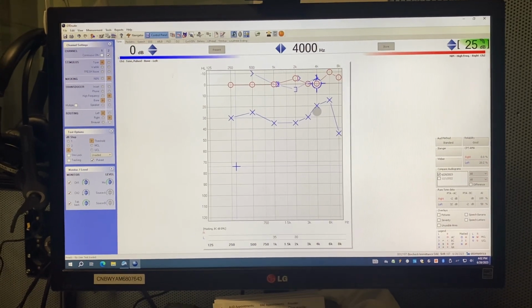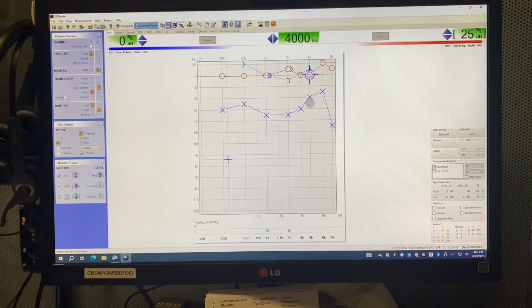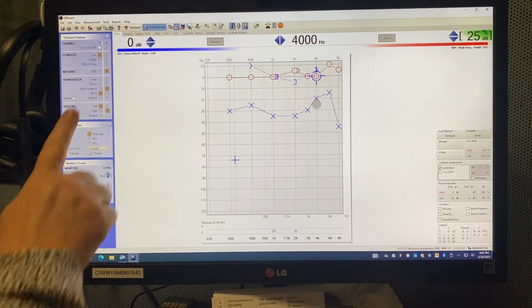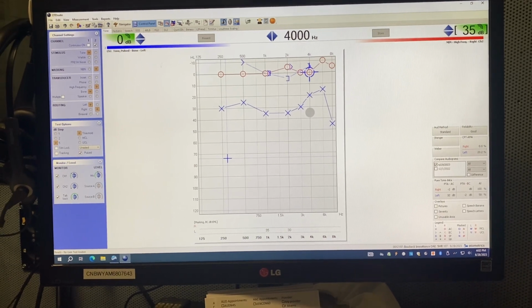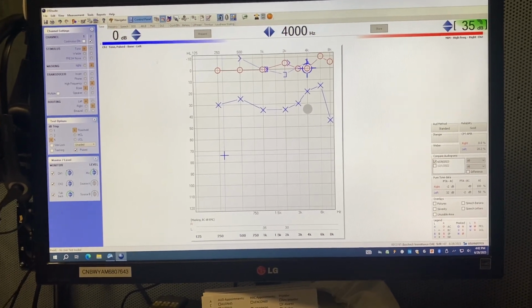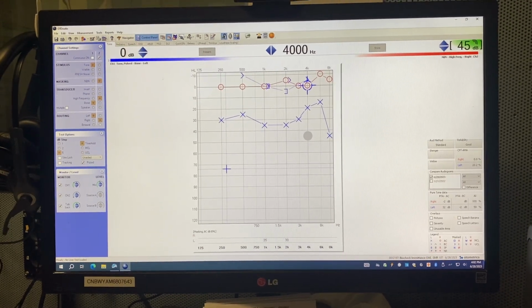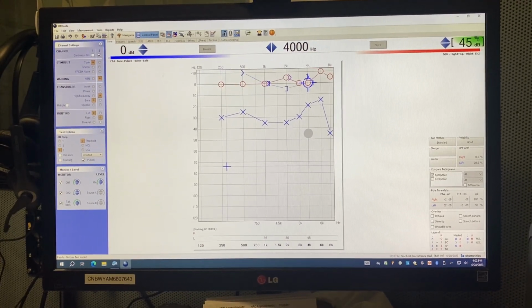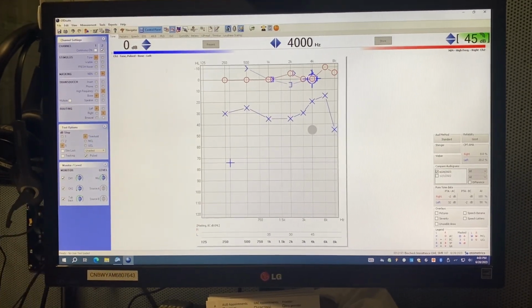No response. Up 5 on your tone. Okay, we got a response at 0. Up 10. Another response. Up 10. Great. We got a threshold plateau of 0 dB.